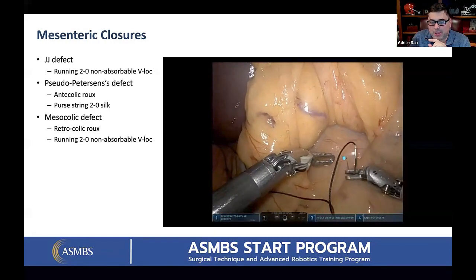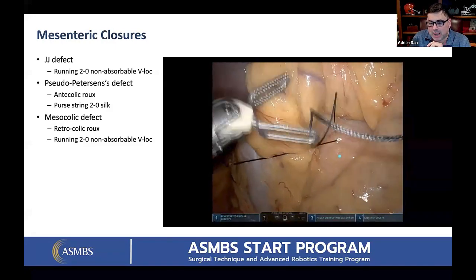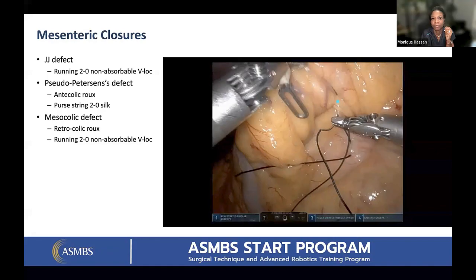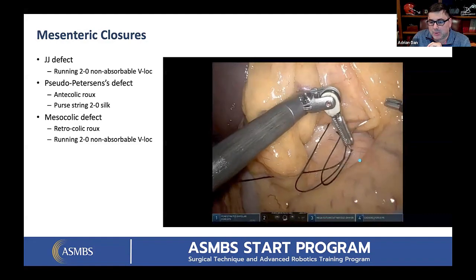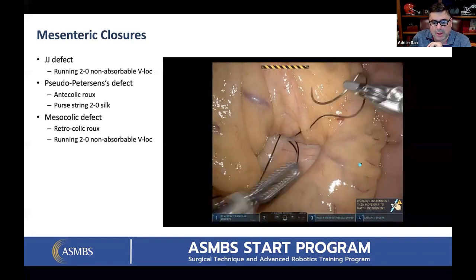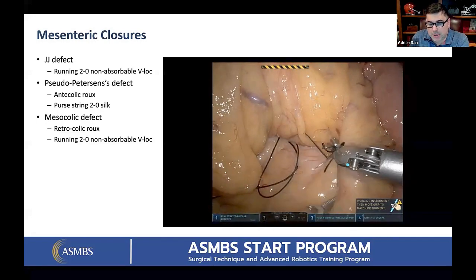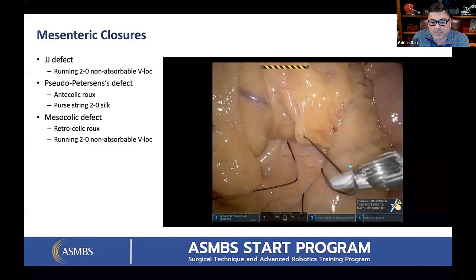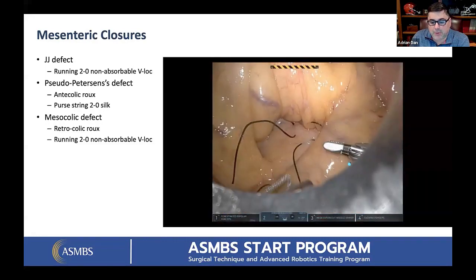But the teaching point there is that all too often as we start a different platform, we try to replicate laparoscopic surgery robotically. And that's a mistake that we make in many aspects of the case. You have to treat the operation differently and utilize the advantages that the robot gives you, rather than try to do the exact same thing robotically that you do laparoscopically. So the fact that we don't have to stand our patients up may decrease the chance of blood pooling in the lower extremities, maybe lower rates of the physiologic insult that we create with a severe reverse Trendelenburg.